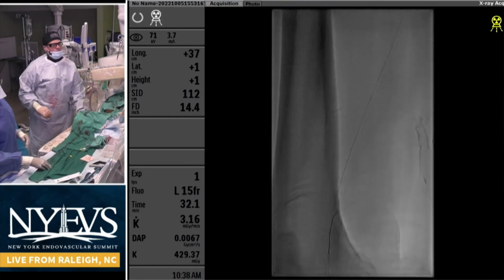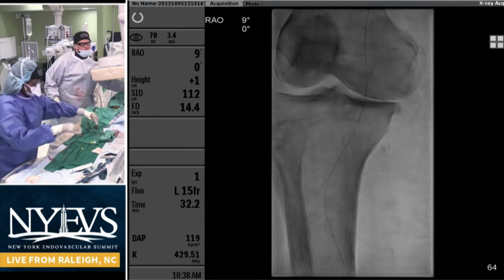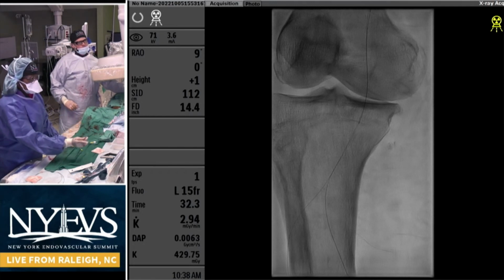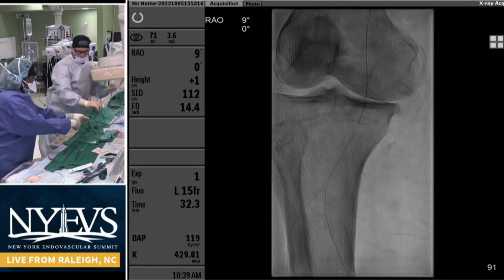Dr. Perugia, what about you? Yeah, no, I agree. I'm a big user of IVUS and ultrasound to try and get sizes correct, because I'd be concerned coming up with a 3.0 from below if we are oversized could potentially disrupt the AT.